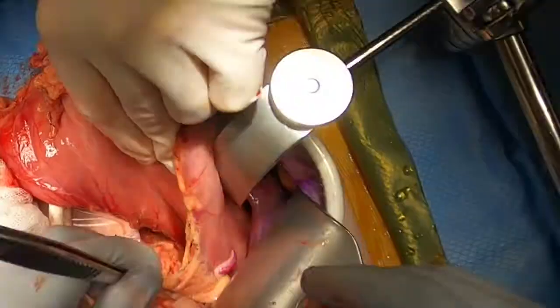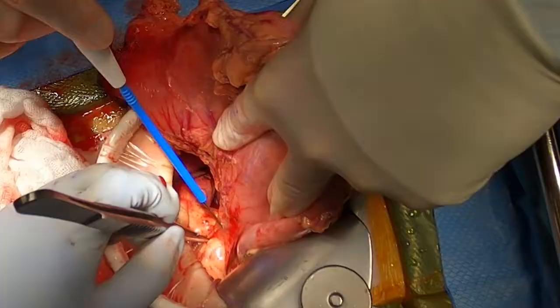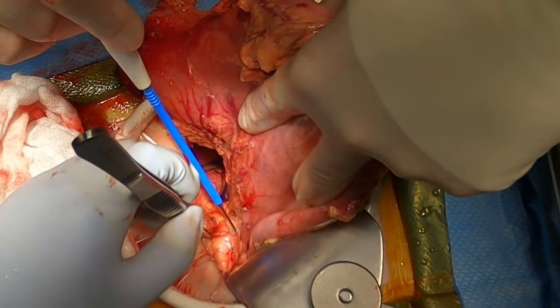Further mobilization of the stomach is achieved through division of the short gastric vessels. Special attention is made to ensure that the posterior branches are also divided to avoid any unwanted bleeding.